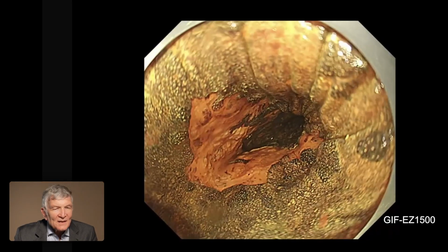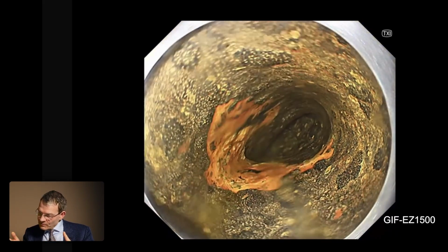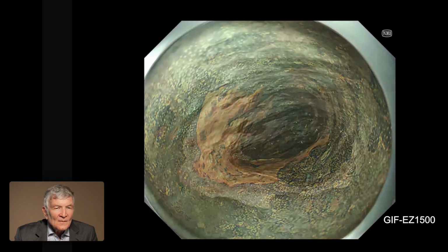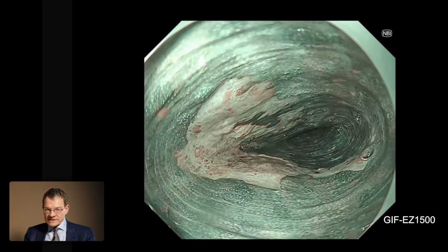And you still do staining? Yes, I still do staining because I want to show you which effects we also have in this combination. So this is Lugol staining. This effect we can enhance with TXI. And for Lugol staining, we use for the neutralization sodium thiosulfate.